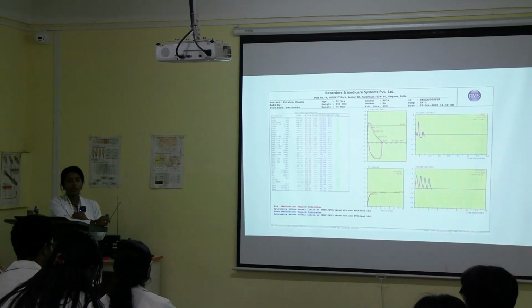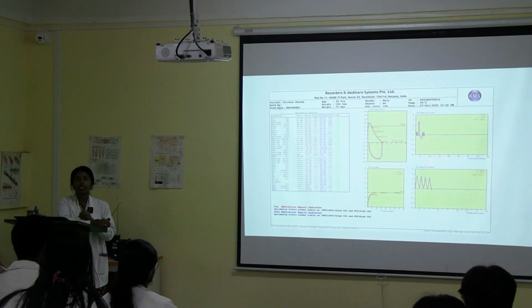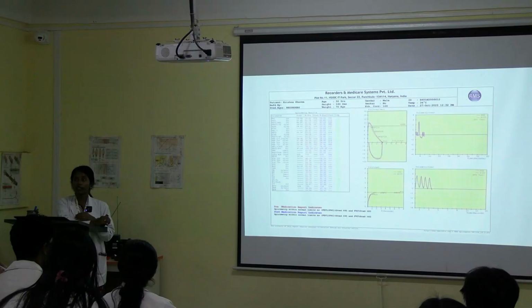After that, it will be set into the computer. Then it will give you the expected values. Then you are going to perform, and the computer will analyze. Is it correct? Is it as predicted? Is it coming near to what they have predicted, or lesser? Then they are going to interpret whether there is any pathology.